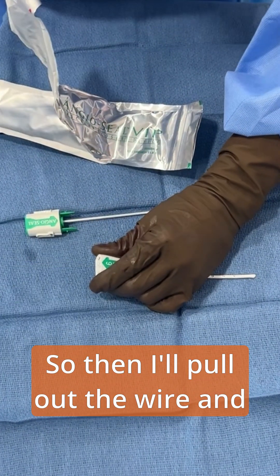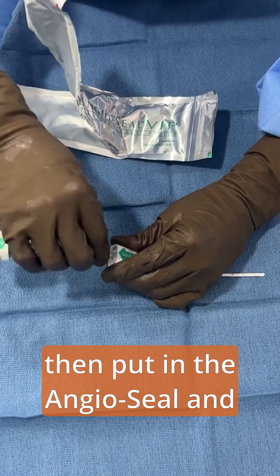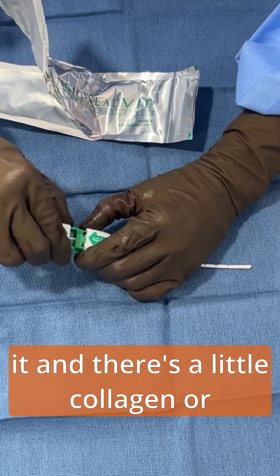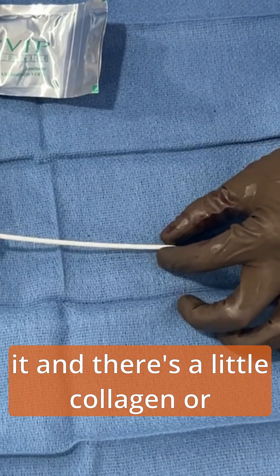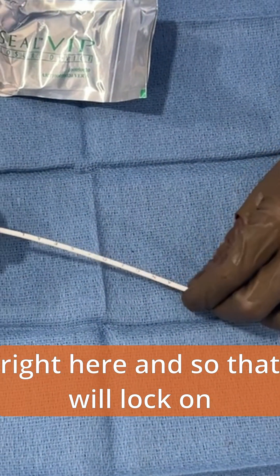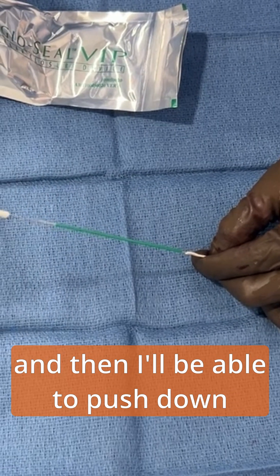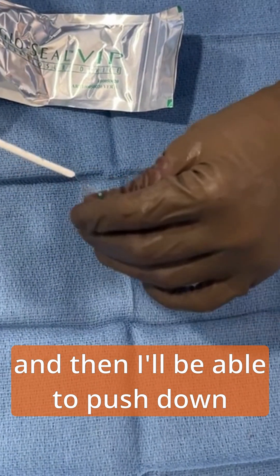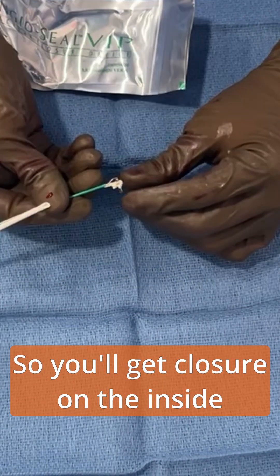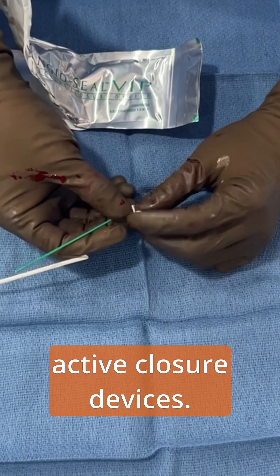Then I'll pull out the wire and put in the angioseal, and you'll be able to see what it looks like on the inside of the artery. It clicks here, and then I can set it — there's a little collagen or a dissolvable footplate right here, and that will lock on the inside of the artery. Then I'll be able to push down this collagen plug on the top of the artery, so you'll get closure on the inside of the artery and on the outside of the artery. These are called active closure devices.